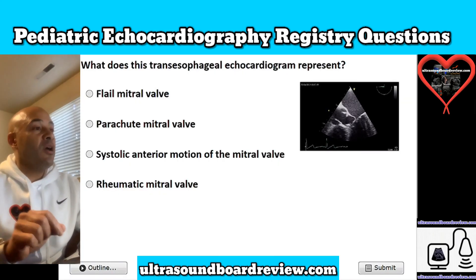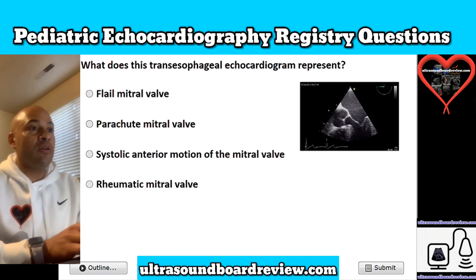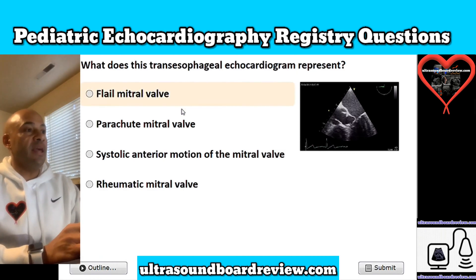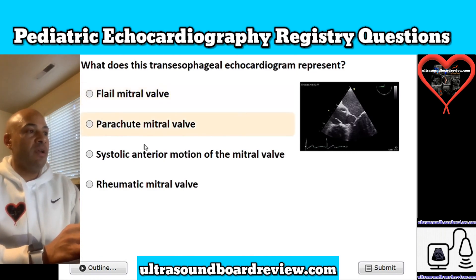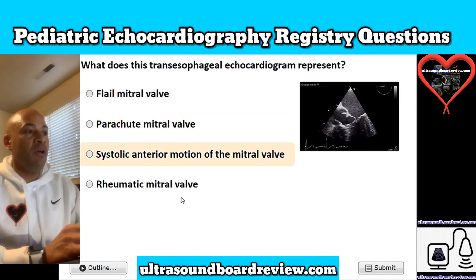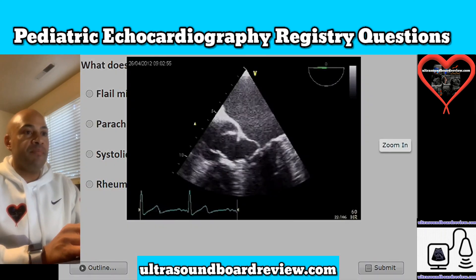Question 5. What does this transesophageal echocardiogram represent? Is it A, flail mitral valve; B, parachute mitral valve; C, systolic anterior motion of the mitral valve; or is it D, rheumatic mitral valve?